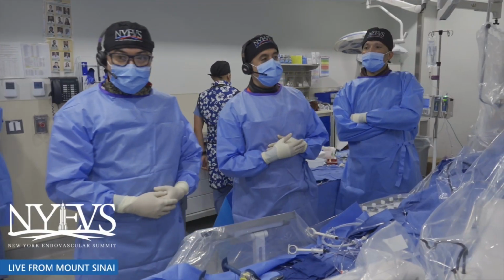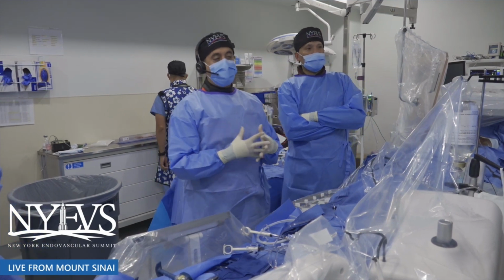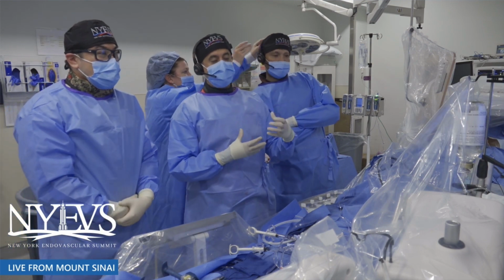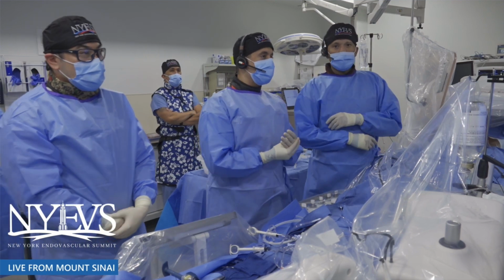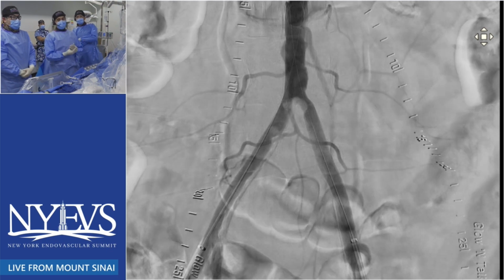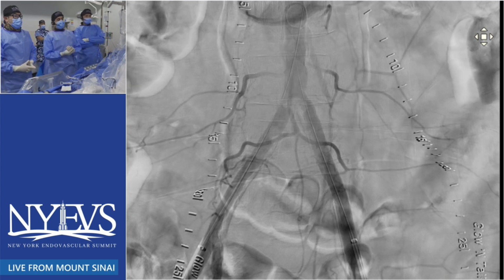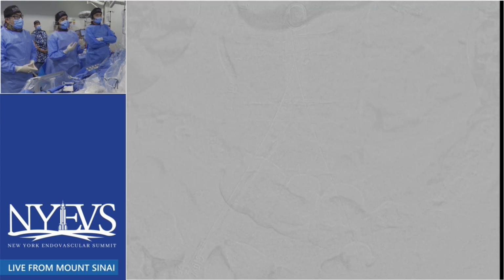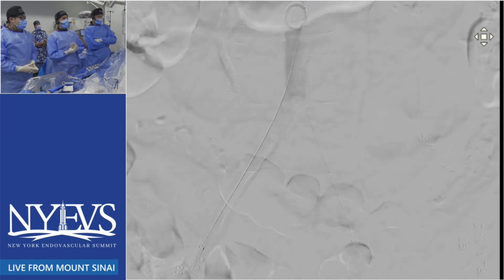Thank you, David. We just wanted to highlight this case. I know it's not like Dr. Metzger's critical CTO, aortoiliac disease, but something run-of-the-mill, which you'll see classically in patients who have the complexity of calcification that needs to be treated appropriately. Our goal was to demonstrate the lesions here, decide on the therapy, and discuss options. The only thing to add is we took a left radial access for better visualization of the arch, because we were suspecting a bifurcation lesion where we might have to do simultaneous stenting as well. So that was the thought process.